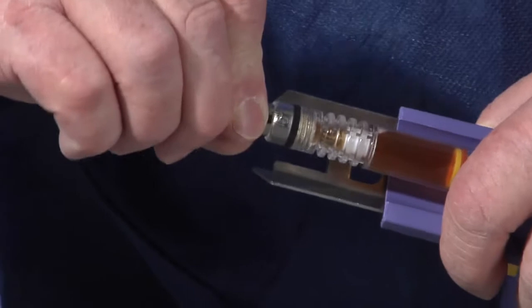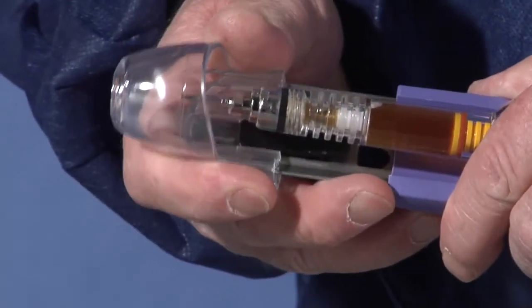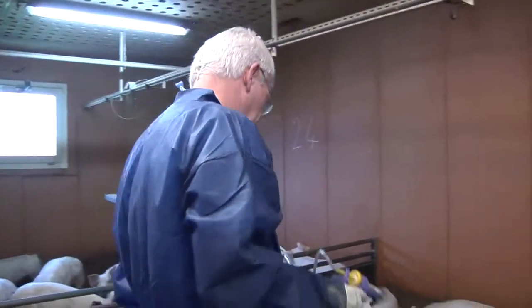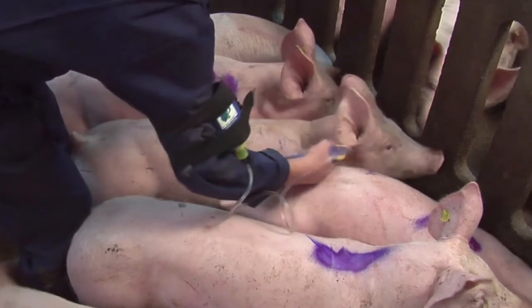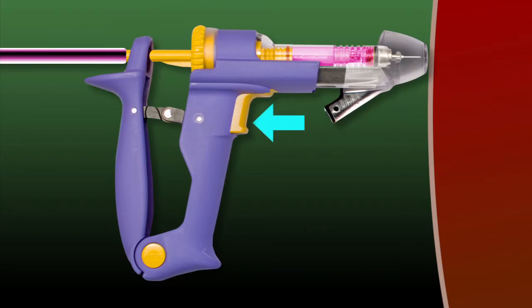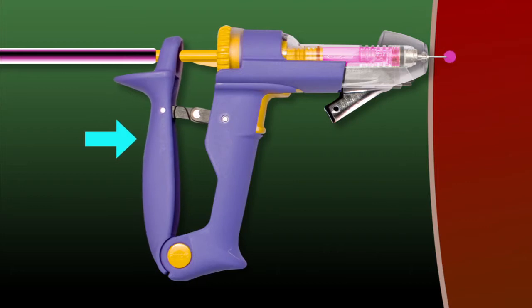You are now ready to start vaccinating. First, a needle is attached to the injector, which has already been primed. The operator can now enter the pen so the pigs become accustomed to his or her presence. Each pig is then injected in the correct site, just behind the ear, and immediately marked on the back. The injector is moved around the skin until it is in the correct position behind the ear. Only then is the trigger squeezed to release the shroud, and the injector pushed towards the pig, and the injection given.